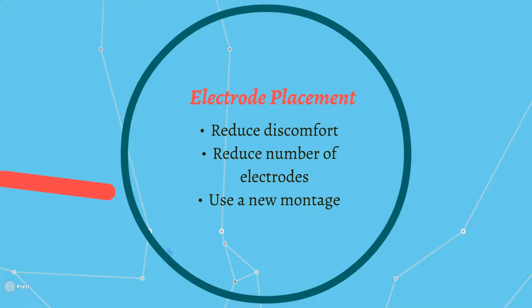One important factor we had to look at was the electrode placement on the patient's scalp. In order to reduce discomfort and reduce the standard amount of electrodes that the 10-20 system uses, a new montage was created by Freedom Laboratories.